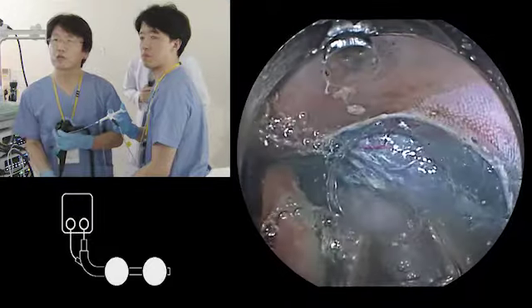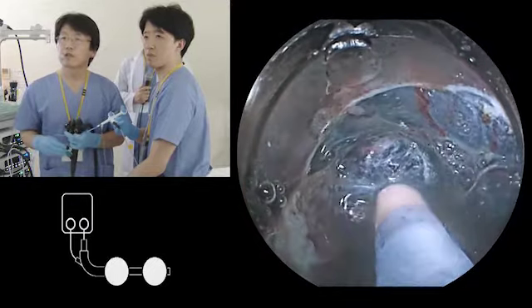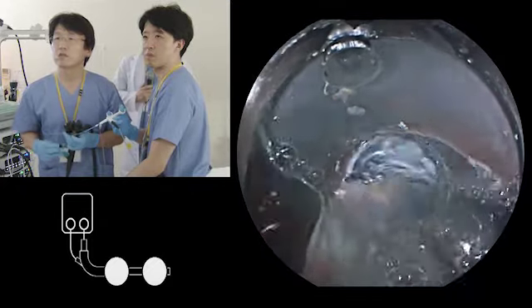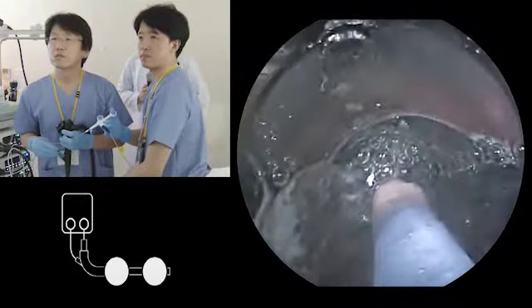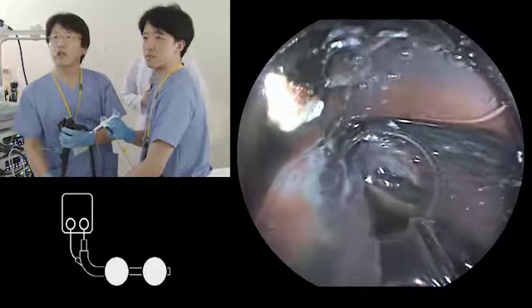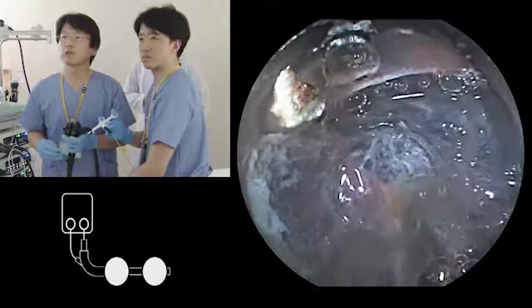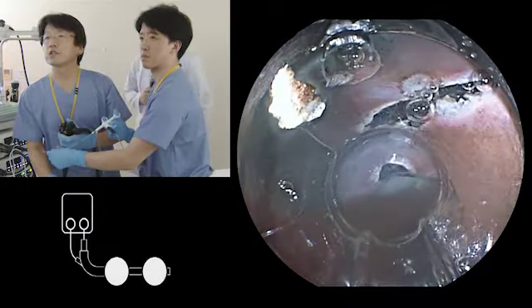Sometimes the approaching angle becomes a little bit vertical at this stage, but as long as you have a thick submucosal cushion, it is fine. Here is the blood vessel, so I coagulate, then cut. Maybe you might think this is a tedious way, but this is very reliable because you will not make the procedure difficult. So only this part remains, and then I can finish this.